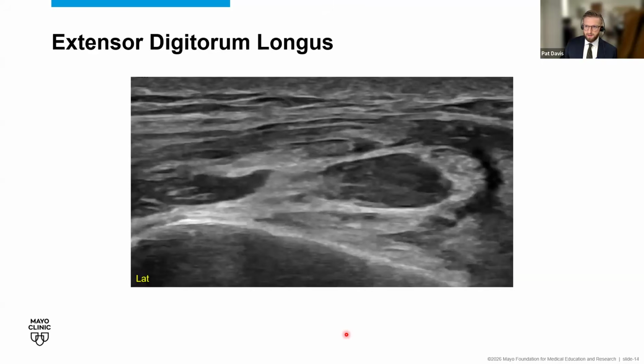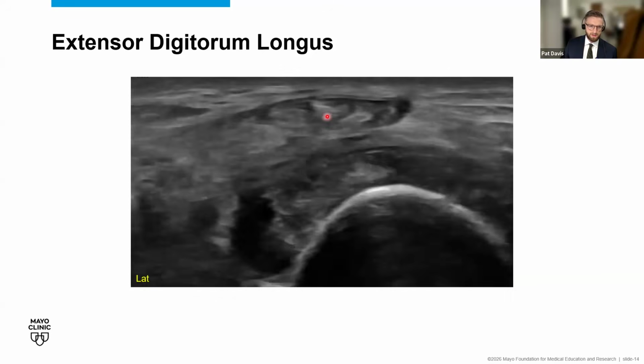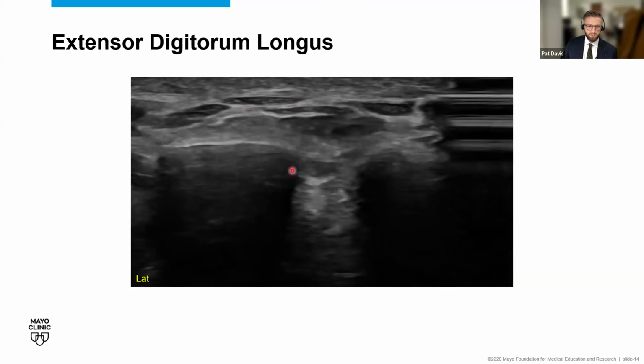For the last of the tendons available in this patient in that anterior compartment, we're now looking at the extensor digitorum longus. So what you'll notice with this tendon is it's a little bit more flattened in comparison, and also will develop into 4 different slips that reach the distal phalanges of the 2nd through 5th toes. So we see the tendon here developing into those 4 separate slips as we follow those slips down, and ultimately would follow them down to their insertion.